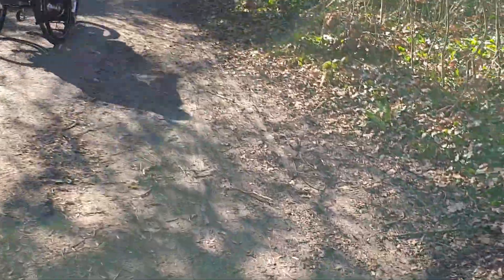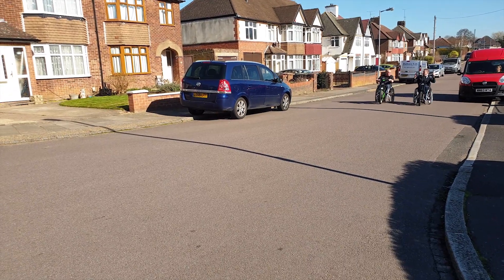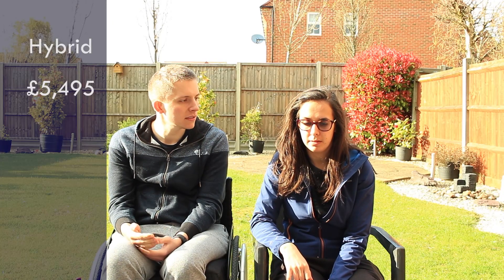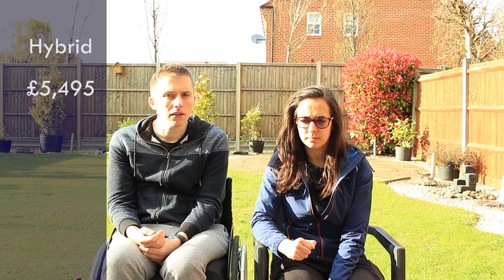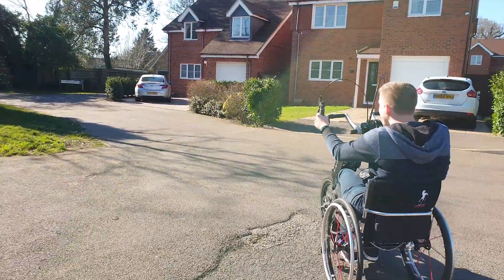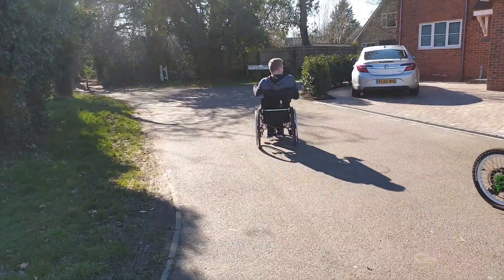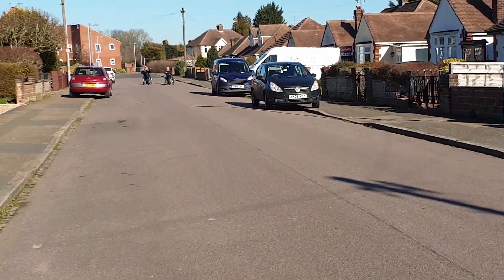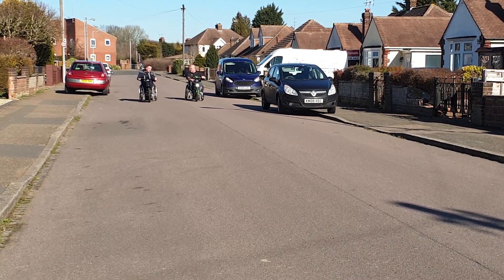It's got five different power levels, although they may be changing their electronic systems. Either way, you can lock the speed at walking pace, so you can go for a walk together, and there are various levels up to the top which they claim can reach about 30 kilometers an hour. Someone we spoke to said they take the electric handbike and their wife goes on a normal bike, and they can keep up at the same speed — in fact he said he coped with the hills better with the power assist.